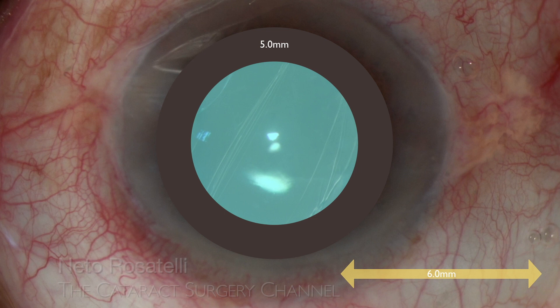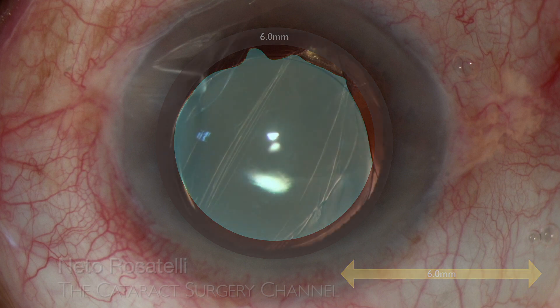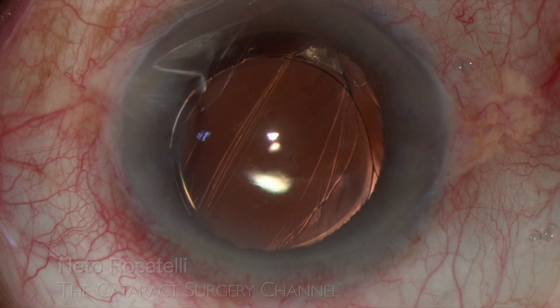Even an unlikely 6mm pupil will result in only a small area uncovered by the IOL. I find the result very satisfactory, as with minimal manipulation, a secured IOL position with adequate centration was achieved, with no need of IOL exchange or fixation. Of particular interest in this case is that this is a four-haptic IOL, achieving outstanding stability when captured.